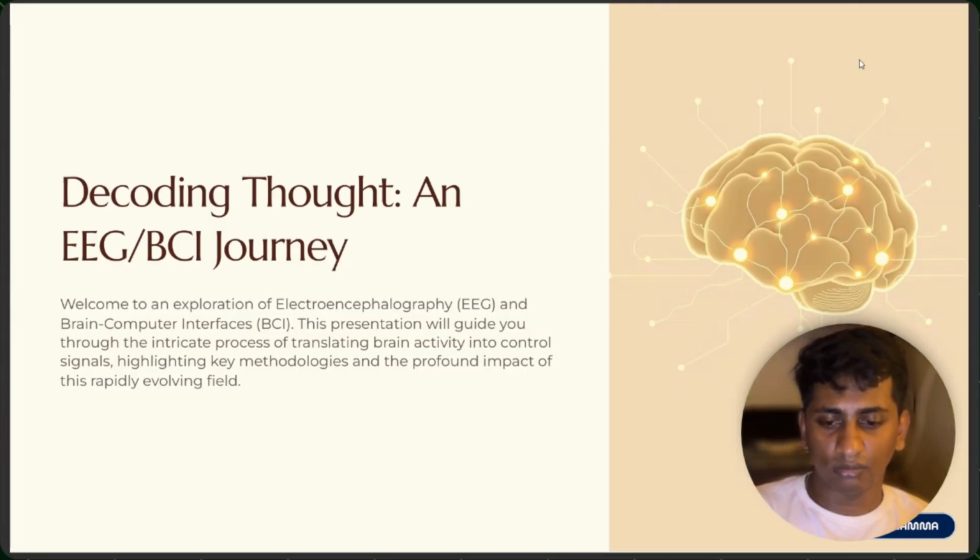Through this assignment, I demonstrated that signal processing and image processing together improve feature richness and classification robustness for motor imagery BCI, brain computer interface.